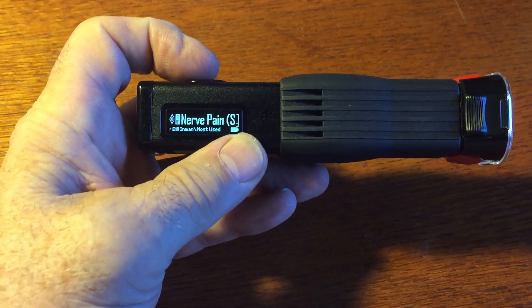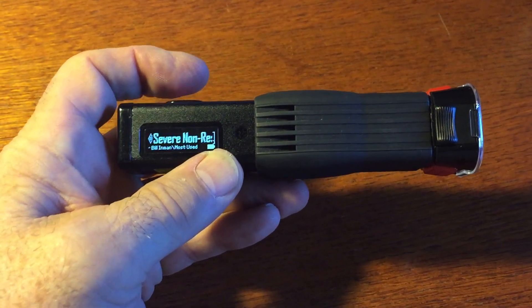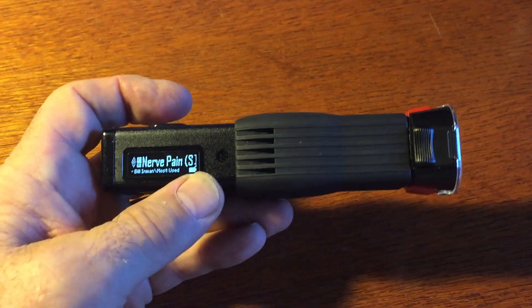The standard mode: down one, and nerve pain is one of the 1,800 different frequency sets we have in there. You see as it scrolls through — we'll choose this one because it's the last one that we used, but there are 1,800 others. About 23,000 different frequencies in this device.